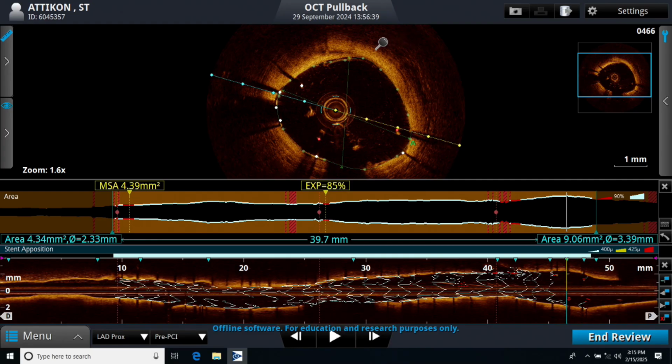The contour of the stent was significantly distorted, also at the entrance. And that could be another reason why it was not possible to get the OCT imaging down. So these are basically the information that you can collect, and then we are going back to this point.